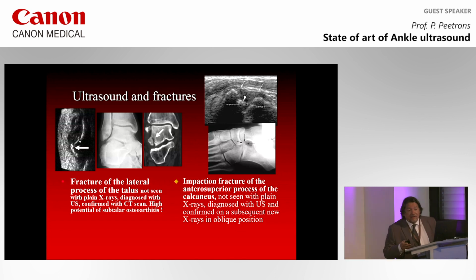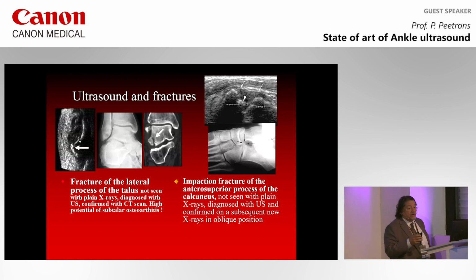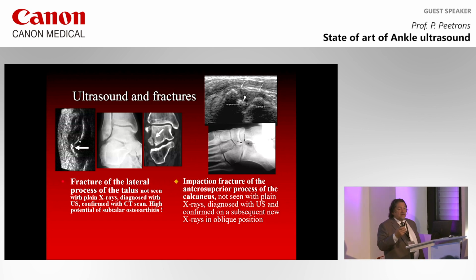Very important. The radiologist, who is in front of his patient, must always ask the patient, where do you feel the pain? This is our major advantage over the radiologist dealing with MRI or CT. He is not in front of the patient. After an examination where I see nothing in ultrasound, I always ask the patient, did I touch the place where you have pain? And then sometimes he says, sorry, but you didn't touch the place. Where is the place? There.